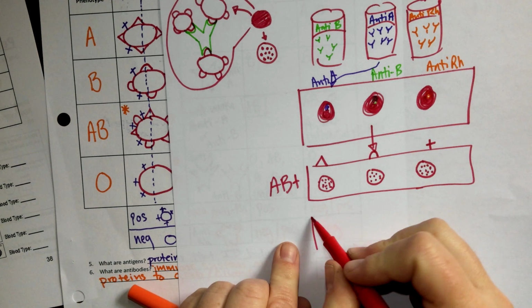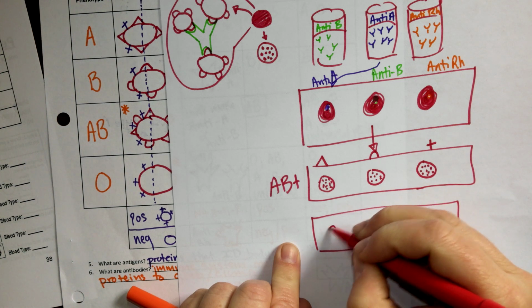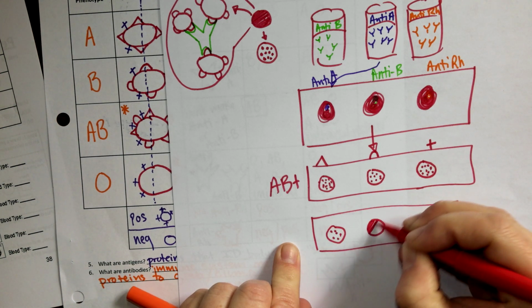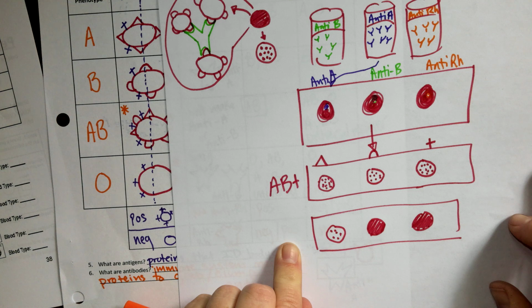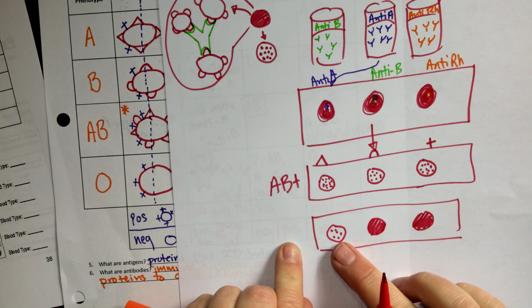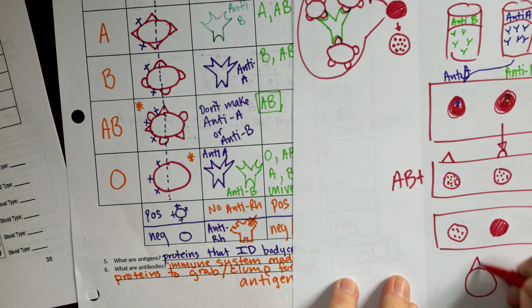So as an example, what if you mixed your blood with these 3 different things and you ended up with one that was clumpy, one that stayed smooth, and RH factor also stayed smooth. Think about that for a minute. What blood type would this person be? Well, since the only thing to clump was the one that had the triangle shape, that means that the blood definitely has to have the triangle shape.